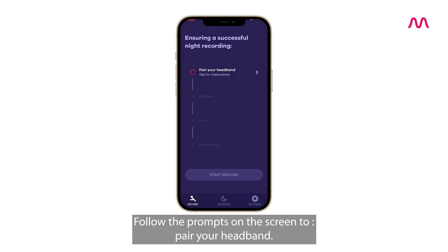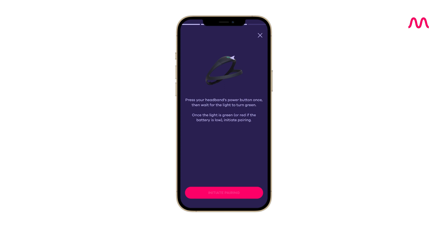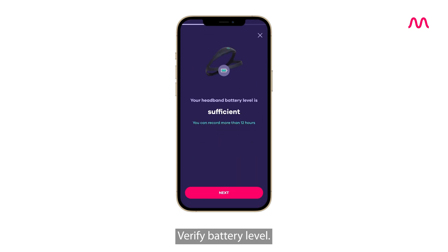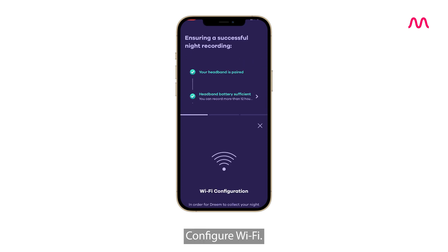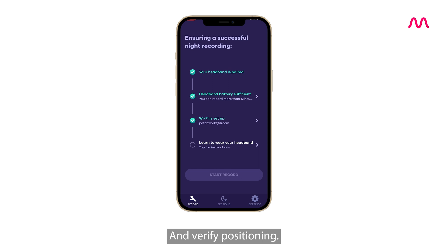Follow the prompts on the screen to pair your headband, verify battery level, configure Wi-Fi, and verify positioning.